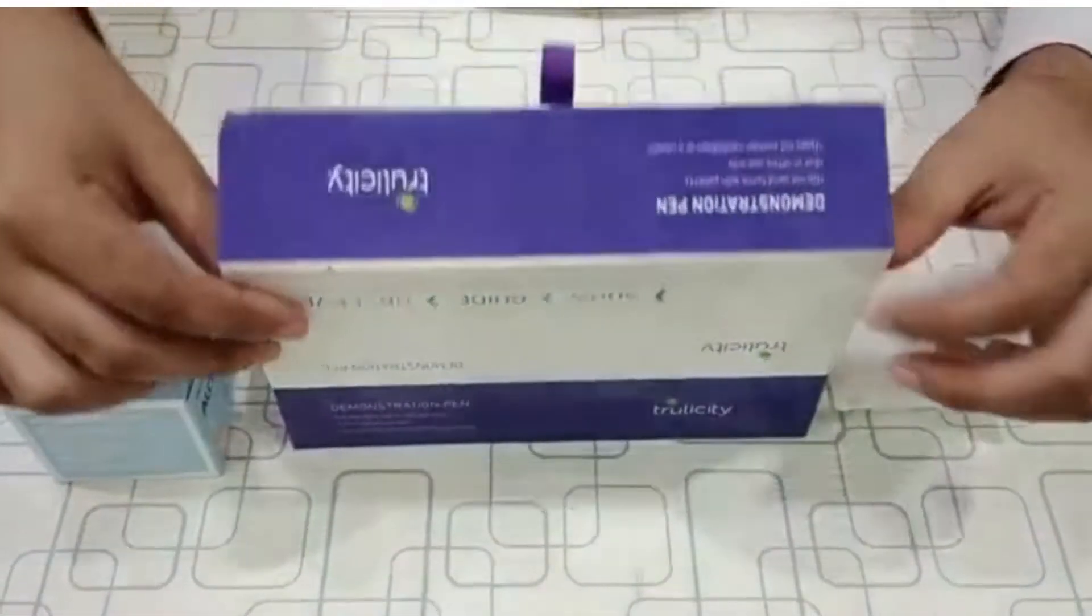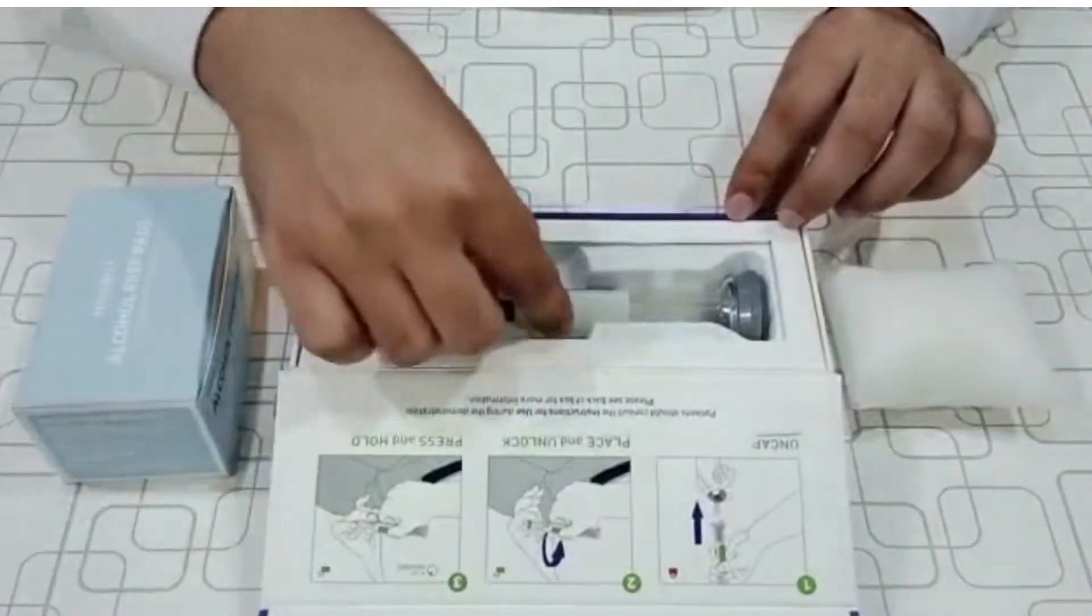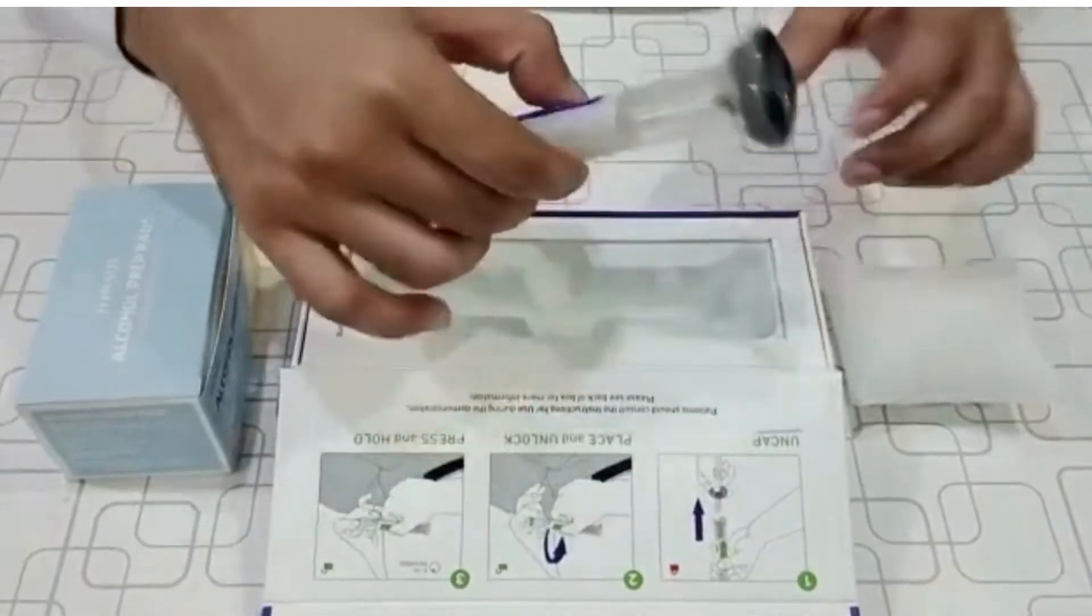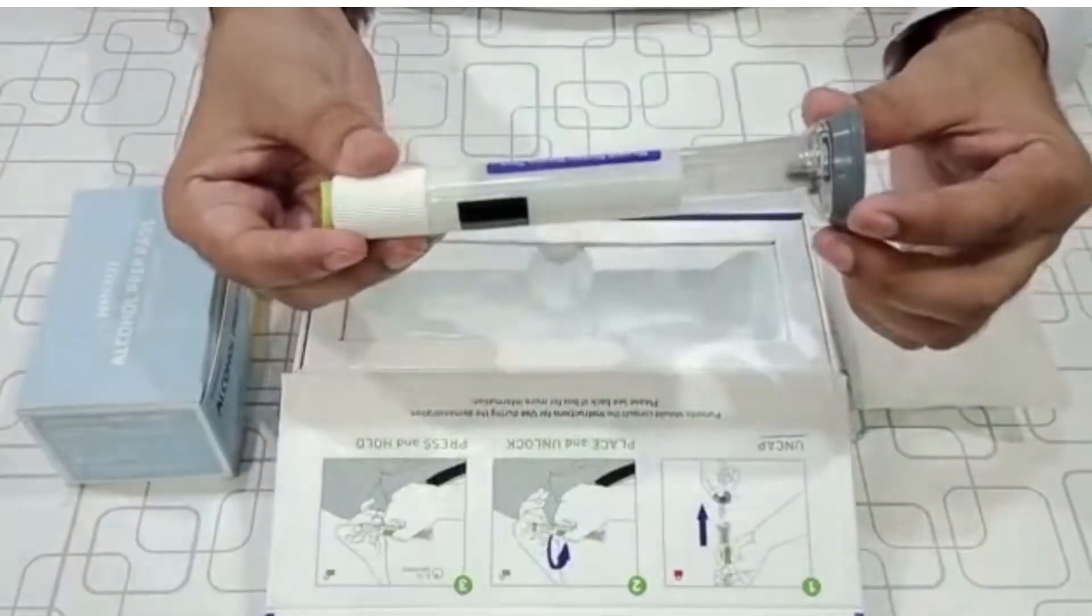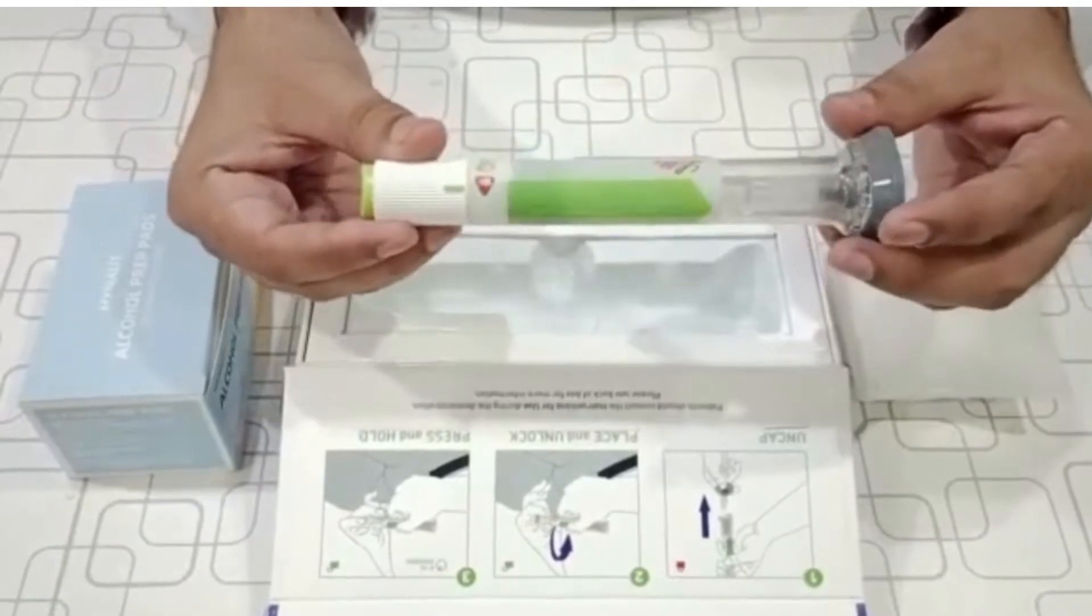Hi, in this video I am going to talk about how to use Trulicity Pen. This is a once weekly dose medication and contains an antidiabetic drug dulaglutide, which is GLP-1 receptor agonist.